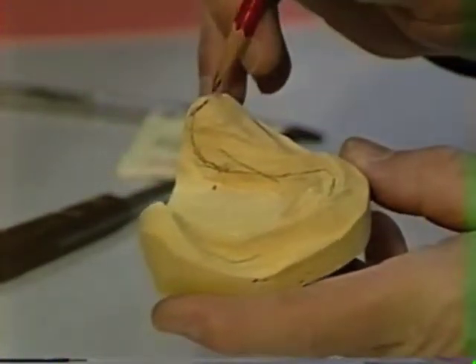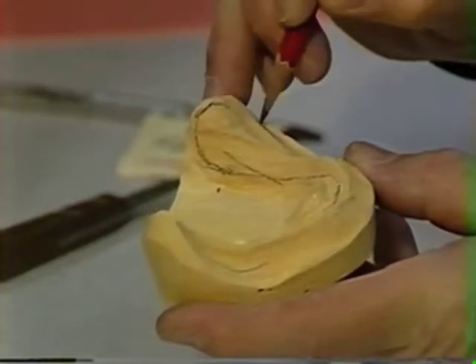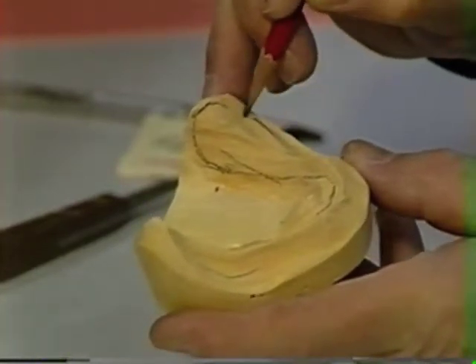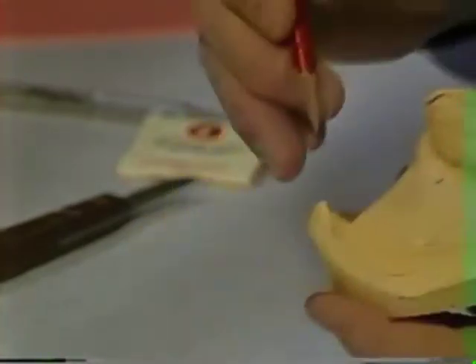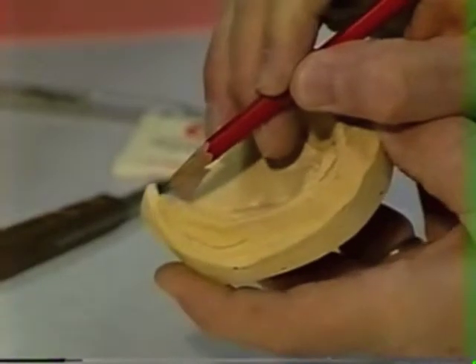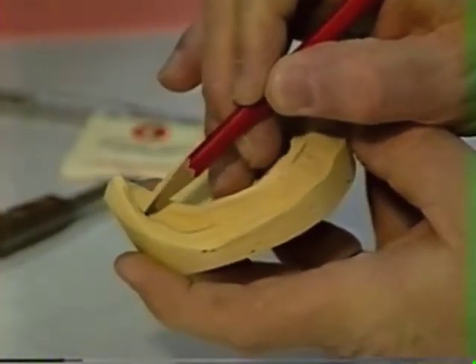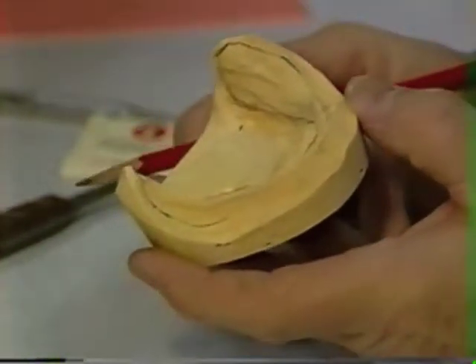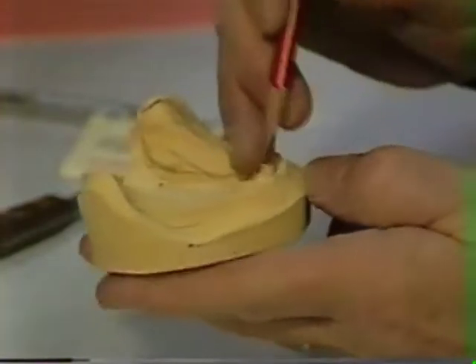So we want to allow our tray to come off of the distal of the retromolar pad at an oblique direction out to meet the external oblique line right in this area. And that's about the extent that you would want your tray. You can do the same on the other side now, from the distal of the retromolar pad obliquely out to the external oblique line. Now, next thing we want to look for is the buccal frenum area.